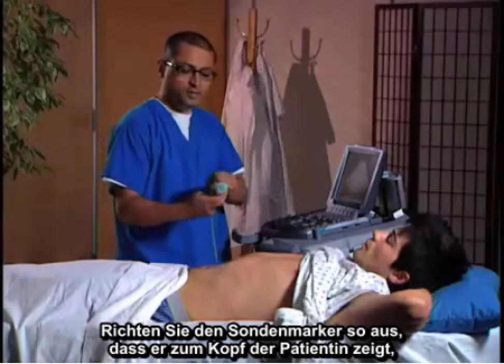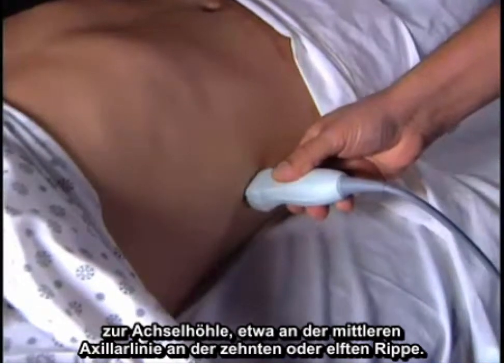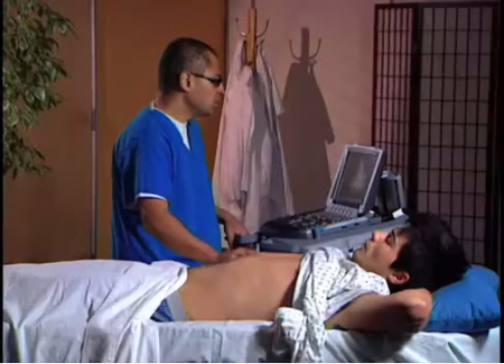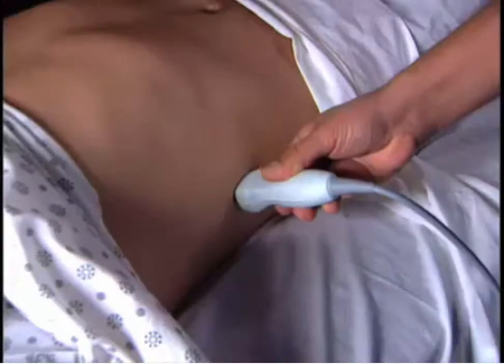I like to put the probe marker toward the patient's head, toward the axilla, at about the mid-axillary line, at the 10th or 11th ribs. Another easy tip to find the location is to get to the costal margin and go about three finger-breadths above it.